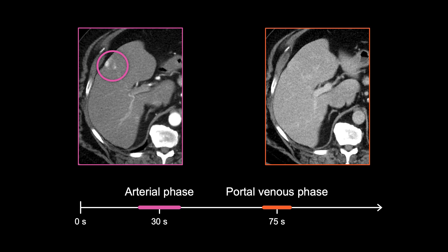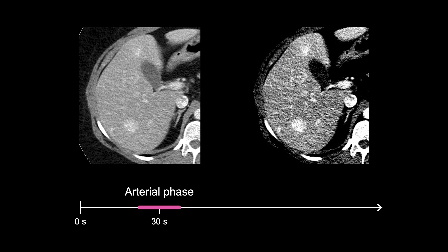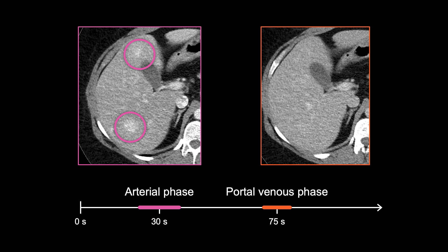In this example of a renal cell carcinoma staging exam, the liver metastasis is clearly visible on the arterial phase image, but nearly impossible to locate on the portal venous phase. In this example of liver metastases from a gastric neuroendocrine tumor, the liver mass is well-defined and easy to see in the arterial phase image, but it really jumps out and we can see an additional mass when the liver window is applied. However, both masses are nearly impossible to see on the portal venous phase.